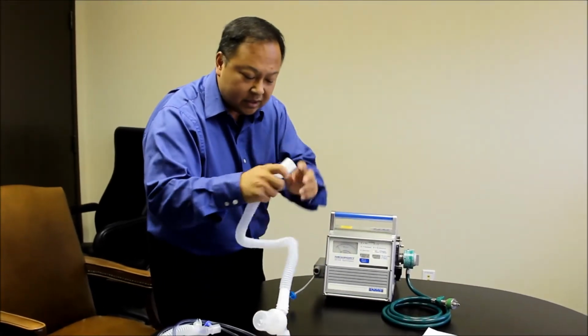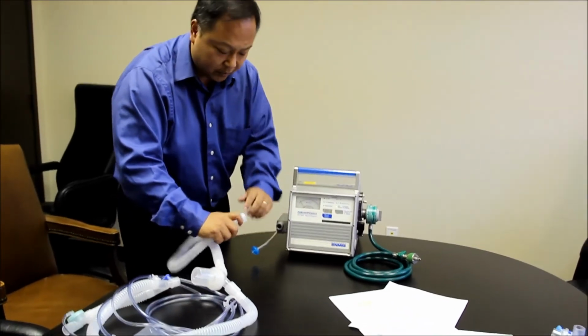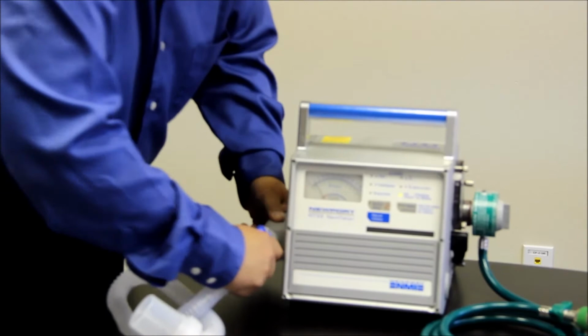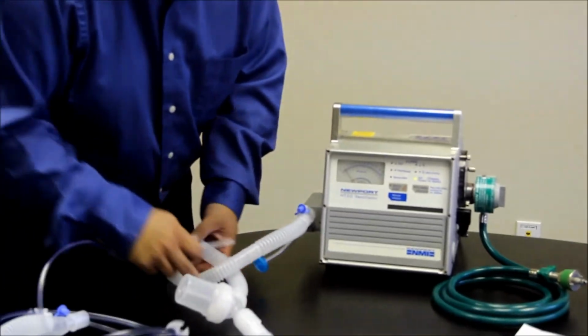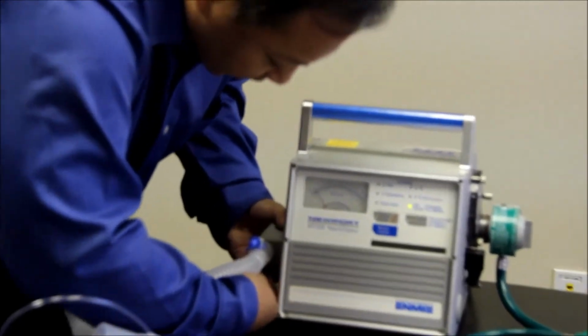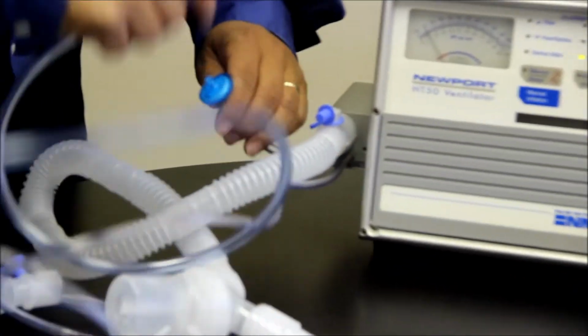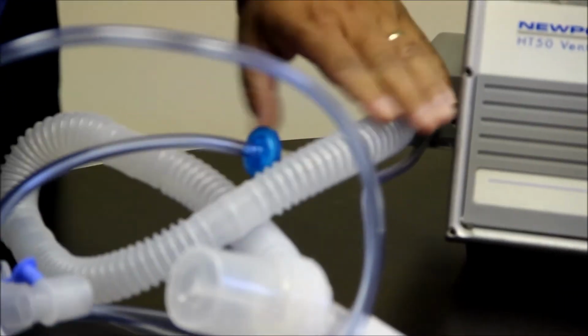So first off, this is the exhalation valve. This is the breath that the machine will be delivering to the patient. It will go onto this inhalation port. And then different ventilators have different connections. But this one, I'll go ahead and set this up. This is the pressure valve, which I'm going to put in there. That's the external pressure valve. And this is the inlet that provides inspiratory pressure to the patient. And that's pretty much it.